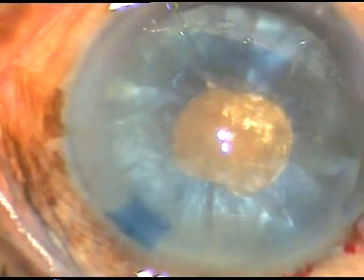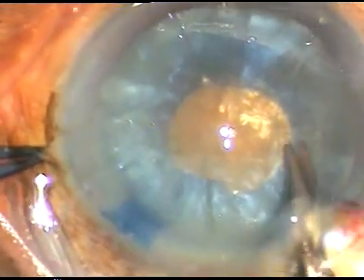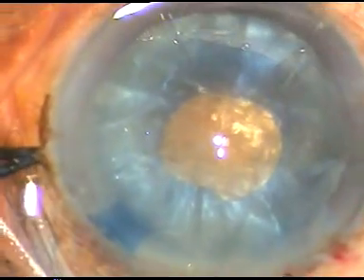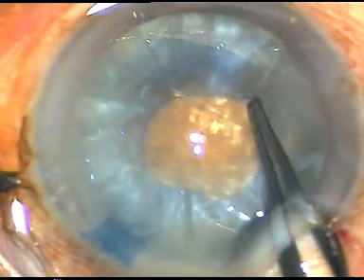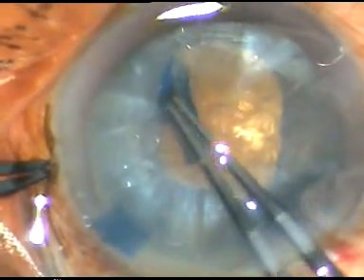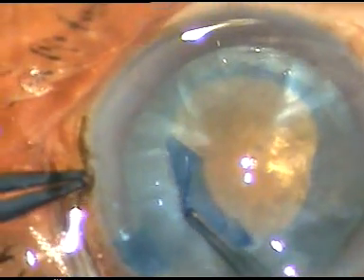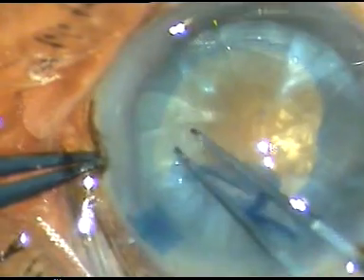Now I make a nick at around 7 o'clock. Take a Utrata forceps, hold this capsular tag and I go anti-clockwise and I enlarge this mini rhexis into an optimum sized capsular rhexis.